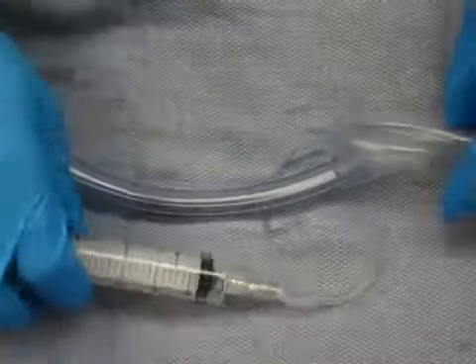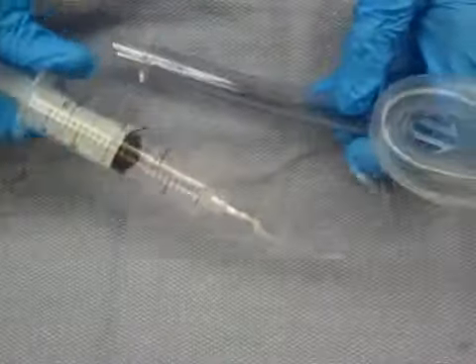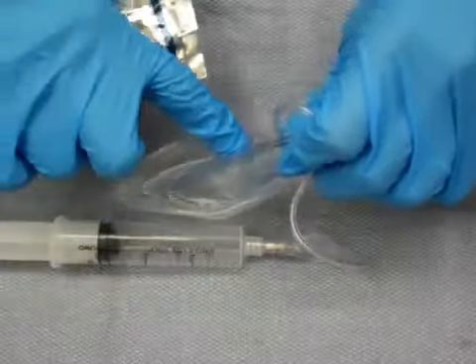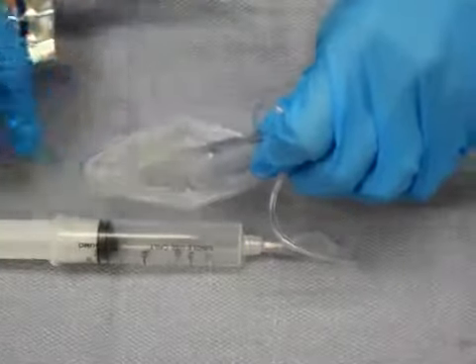Prepare the device by first removing all excess air from the bladder. Then lubricate the posterior surface of the cuff to facilitate easy and smooth passage into the mouth. The posterior surface is the side opposite where air exchange occurs.